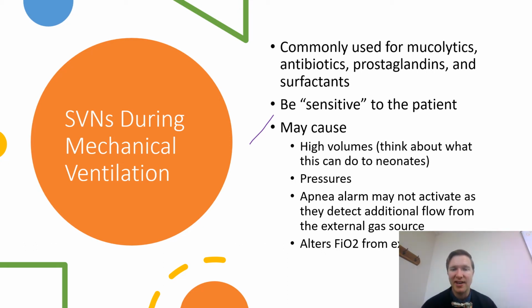A big ask. And so that's one of the issues that you have to worry about, is asking them that big work of breathing effort. Is that worth it, right? And so that's something that you got to be very careful of, because that could cause a lot of asynchrony with that patient. These may cause high volumes if you're running pneumatic nebulizers, because what are we looking at here?